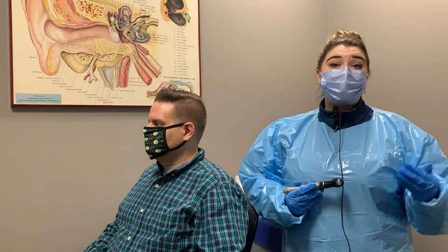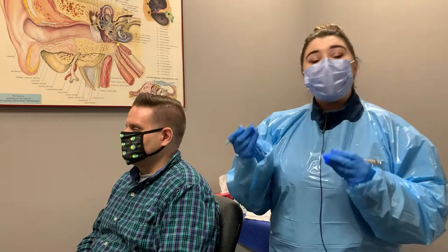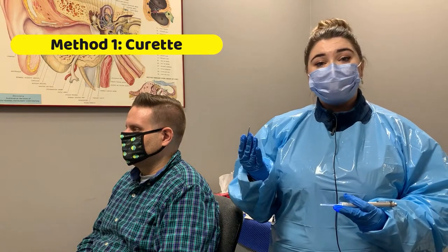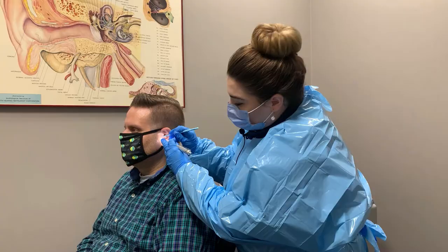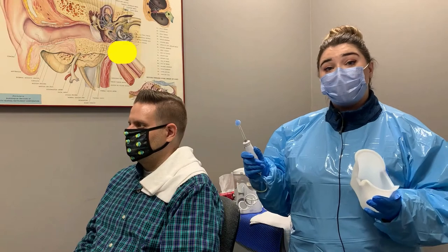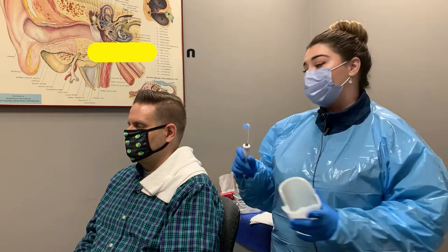After looking in your ear, we will determine what method of wax removal is best. One method that we use is with the curette — it is good for wax that is close to the ear and can be scraped out easily. The next method is irrigation, which is a really good method if the wax is deep and impacted.